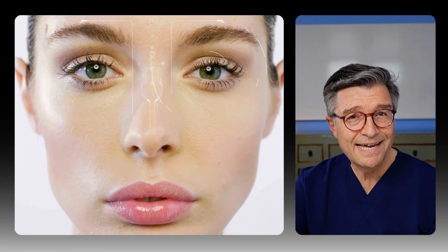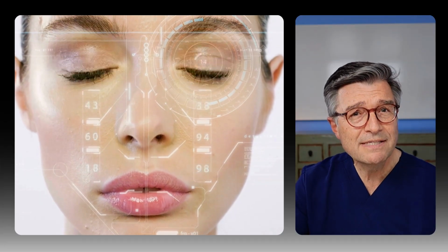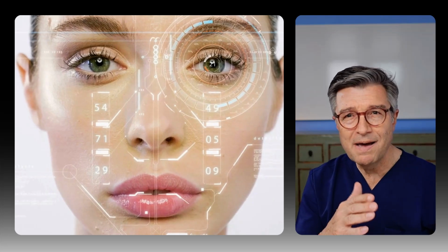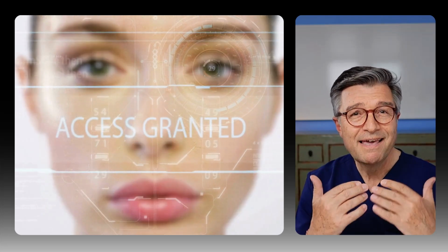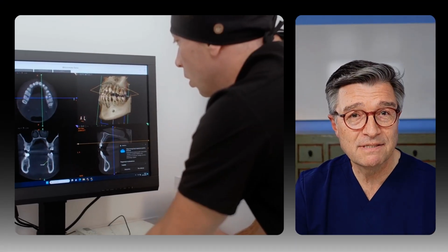Video and face scan. This is the most underused yet powerful tool. Video lets us capture the patient in motion, smile, speech, lip mobility, emotional expressions. Face scanning provides a 3D map of the patient's face, integrating facial proportions, symmetry, and aesthetics into your treatment planning software.